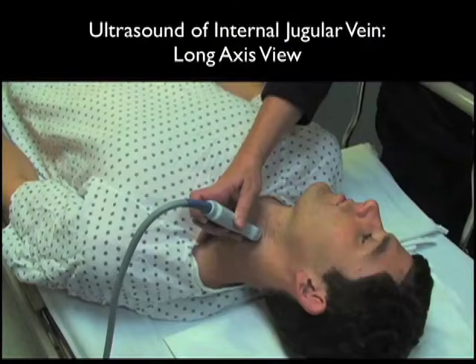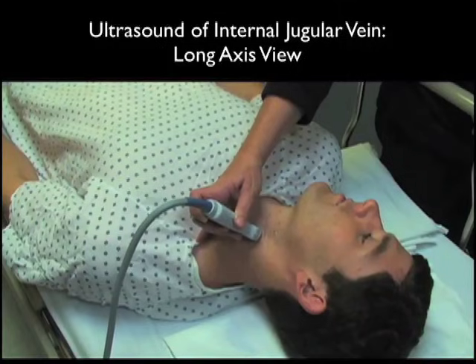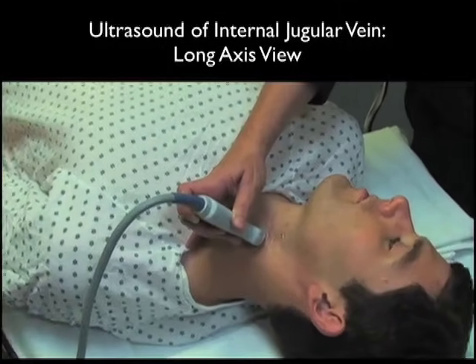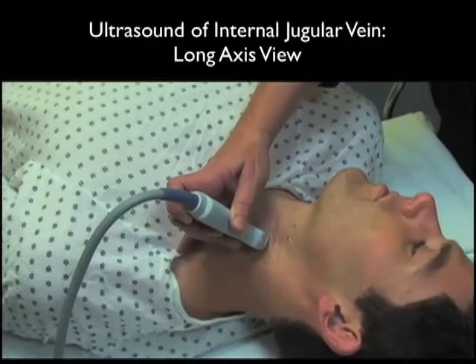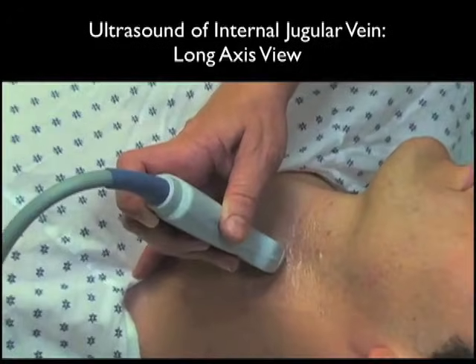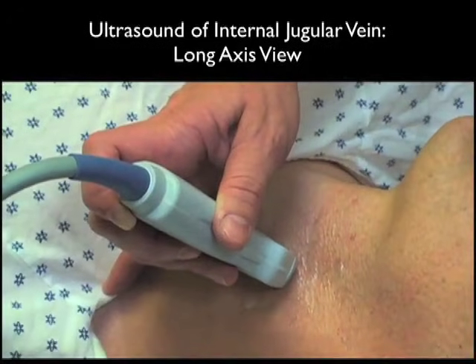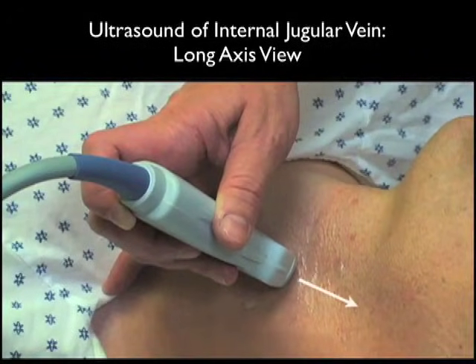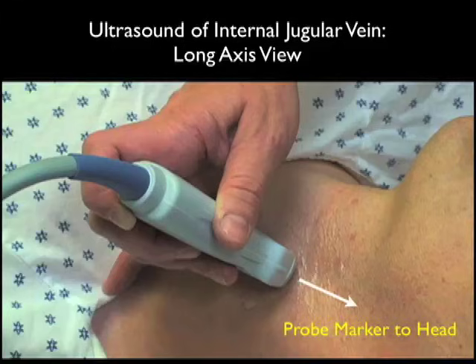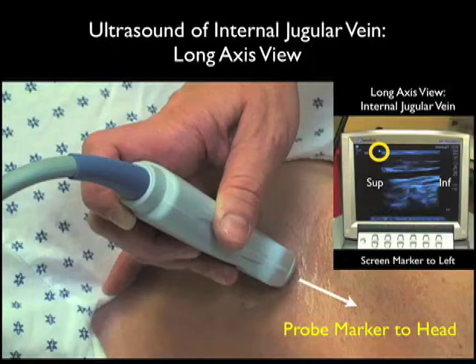Here's the high frequency probe placed in a longitudinal or long axis manner on the patient's neck. Notice here that it's running along the course of the internal jugular vein as it runs up and down the patient's neck. By convention here, I like to have the probe marker towards the patient's head.